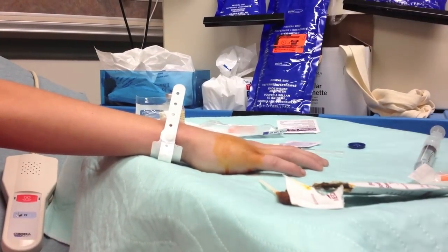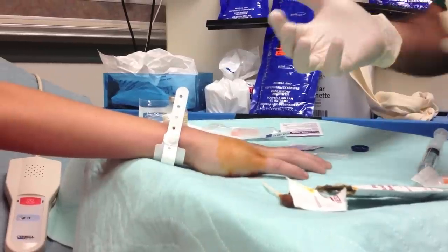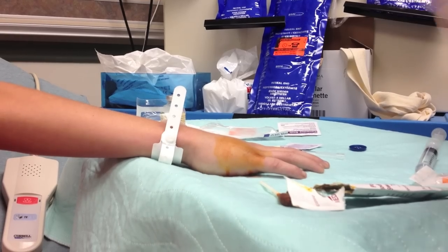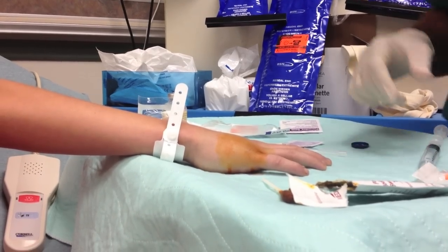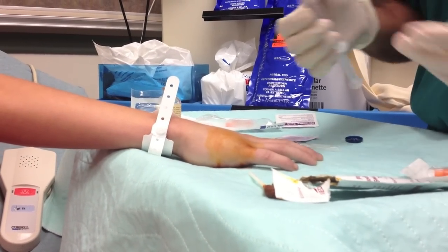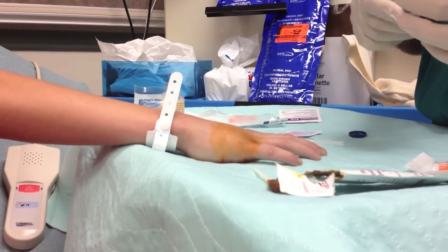The fracture is right here — it's 45 degrees angled towards the volar surface. We're going to do a hematoma block, which is essentially the blood clot that's there from the broken bone. We go into the fracture site, pull back until we get blood, and then we know we're in the right place. Then we put a bunch of medicine in there.